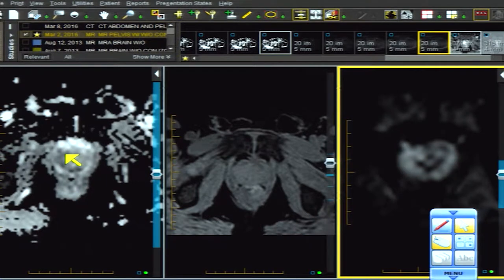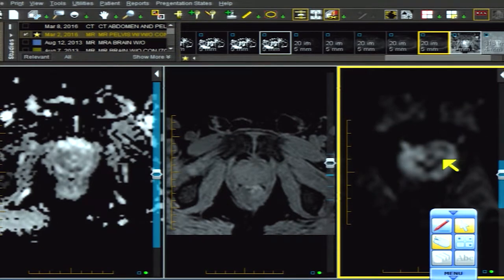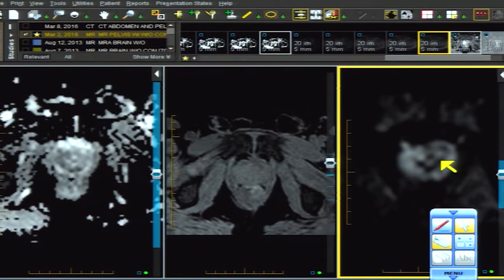Let's go to the DWI with a B value of 1600. We like our B values to be 1400 or greater to do the job of showing hyperintensity in the prostate — simply going over 1000 is not sufficient. Diffusion restriction occurs because of viscosity, desmoplasia, cell packing, and even cell membrane death with influx of fluid into the cell itself — restriction of water motion.